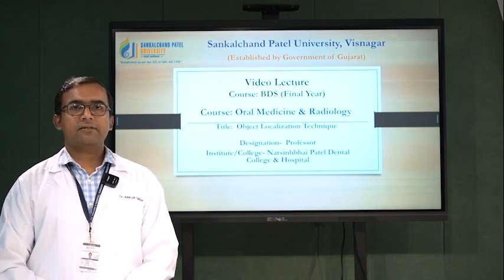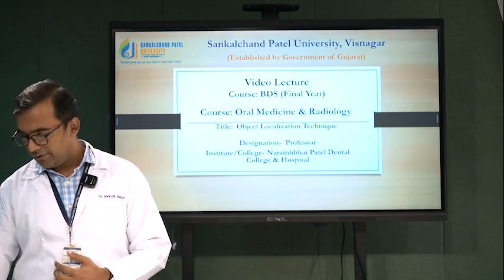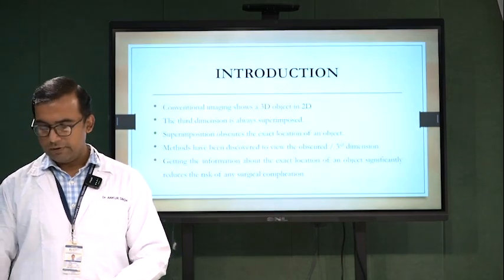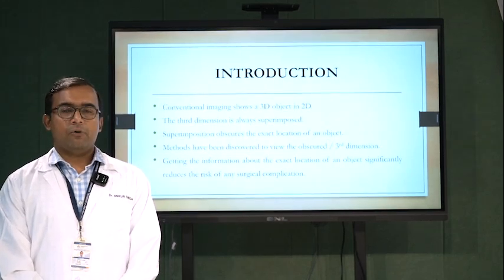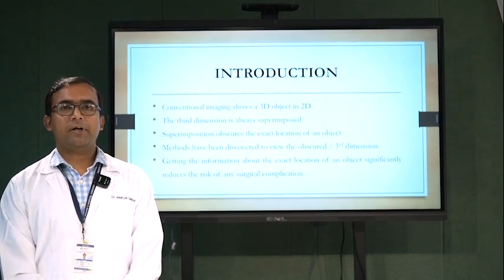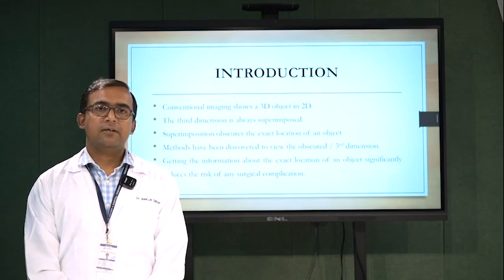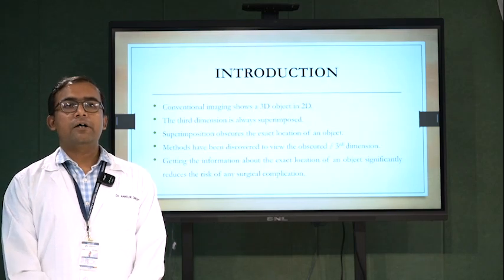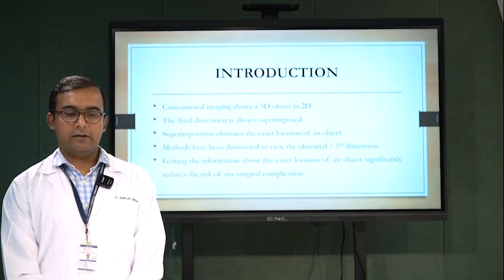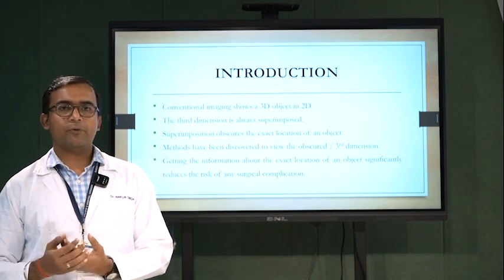The topic for today's lecture is object localization technique. Now here we start with the lecture. So in radiology we commonly perform IOPA. IOPA is the intraoral periapical radiograph that exposes a three-dimensional object and gives us a two-dimensional image. So the third dimension or the depth of the object is always obscured or superimposed.